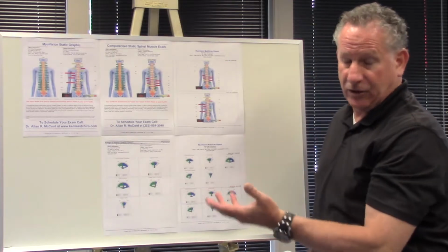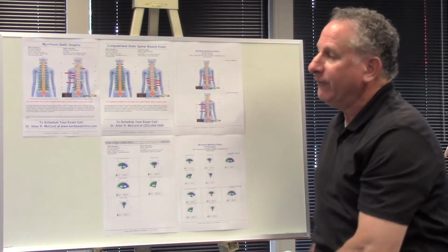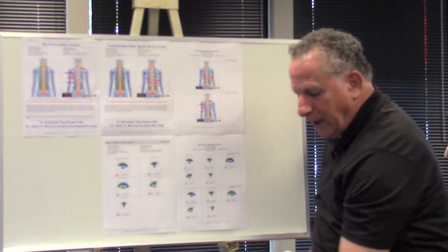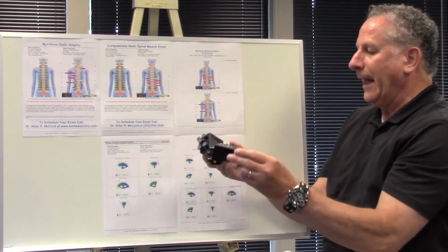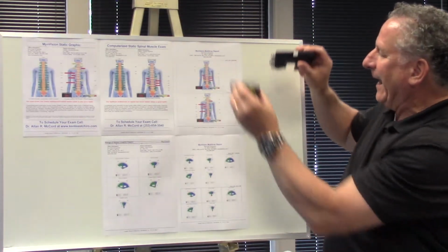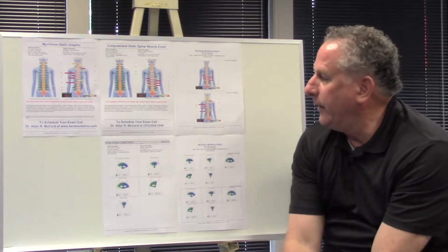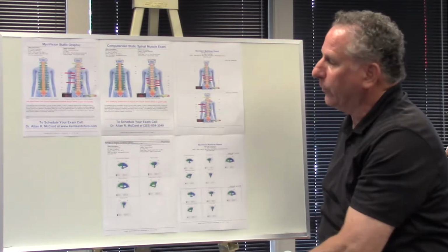What this gets a chance to show the patient is what we feel when we do a palpatory test, when we feel up and down a patient's spine. But we can show that to the patient after we do one of these computerized tests. To do that, we use a dual probe instrument that's Bluetooth into the module. We take these probes and scan 24 spots down the spine, and it takes about 90 seconds to run this test. You can see there's 5 electrodes on each one of those probes, and we can then show the actual muscle tension that's associated with what's going on in the spine.